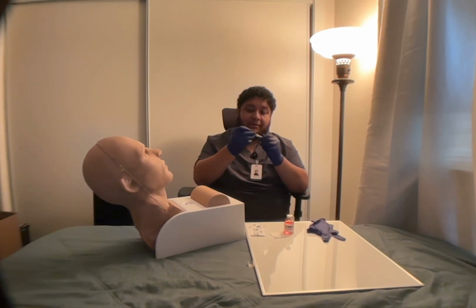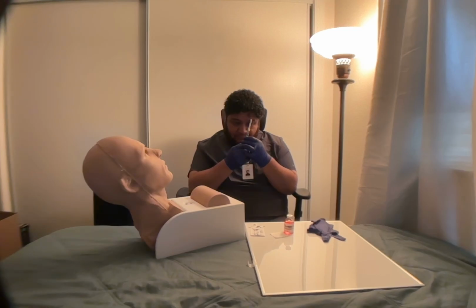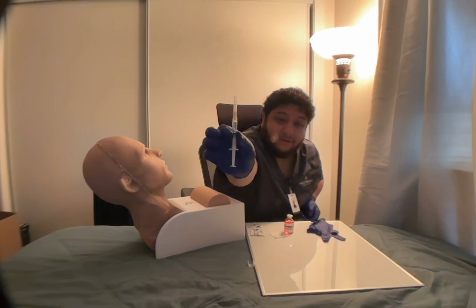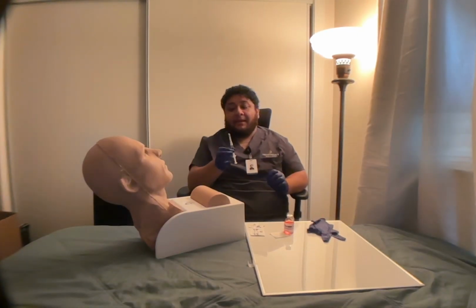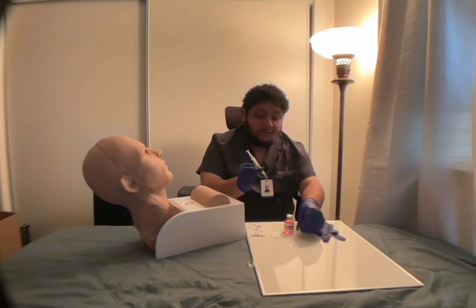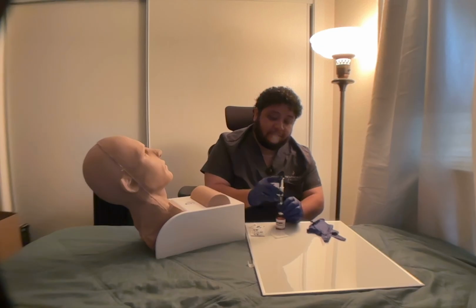Connect. Make sure it's securely fit. Now I'm going to draw 1.5 milliliters of air, like so, verifying the camera just to make sure. Okay, now I am going to remove the cap and insert the needle into the medication vial, and I'm going to push the air out.